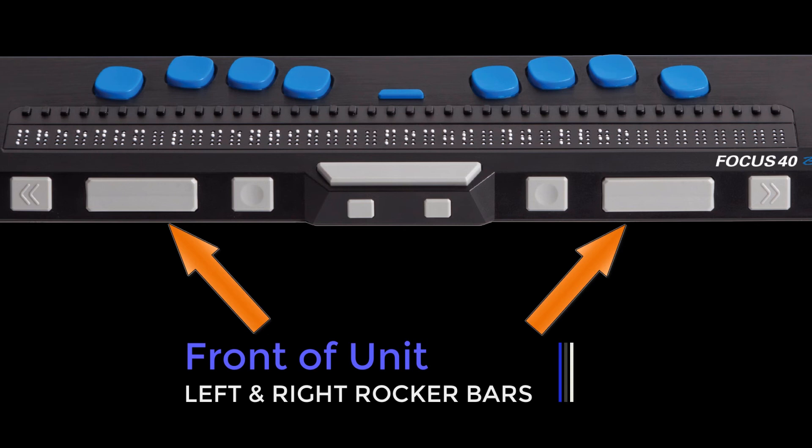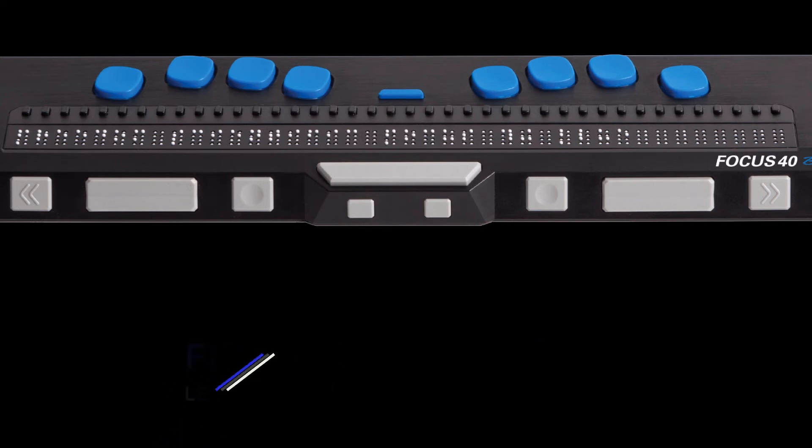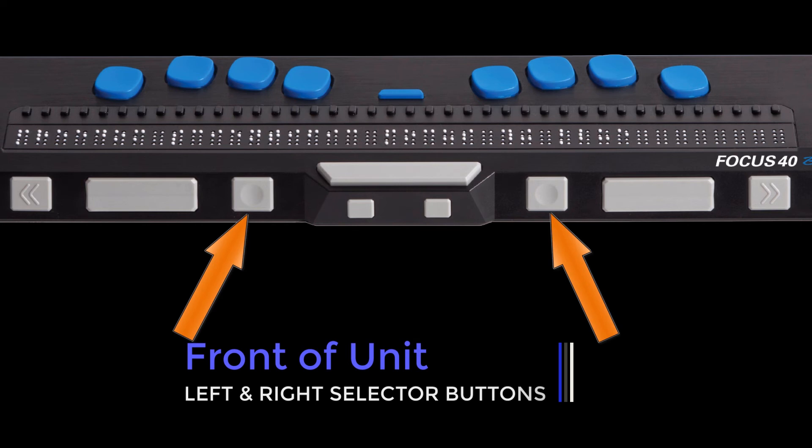Rocker bars move the display up or down. Press the top of the rocker bar to move up one line; press the bottom of the rocker bar to move down one line. Used by themselves, the concaved selector buttons control auto-advance — a feature that advances the display forward automatically as you read, so you don't have to do it manually. Press both selector buttons together to toggle auto-advance on or off. When pressed in combination with other controls, the selector buttons perform multiple functions.